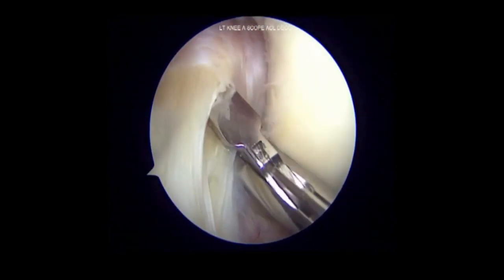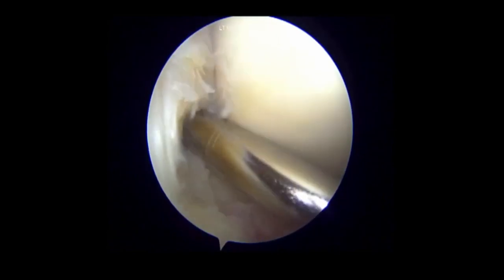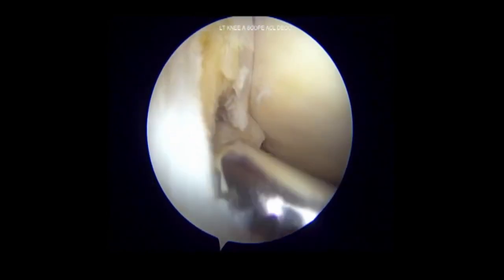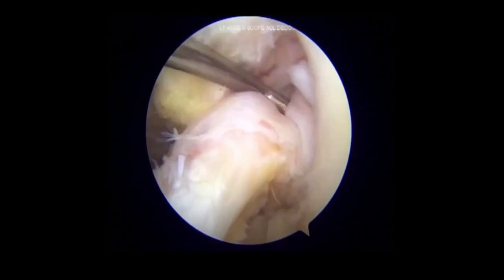The scope is then switched to the anteromedial port and a biopsy punch is inserted to begin with removal of the posterolateral bundle, followed by a 3.5 mm shaver to complete the removal of the posterolateral bundle. Yellow looking degenerate ACL fibers are seen at this point in time.